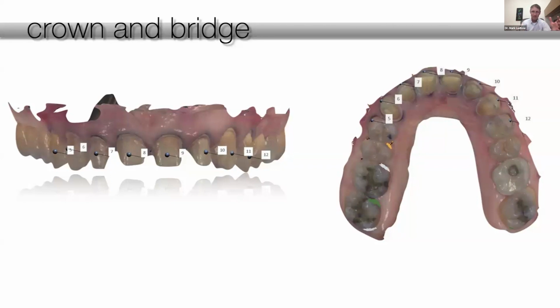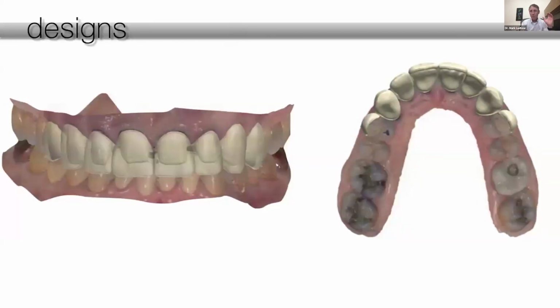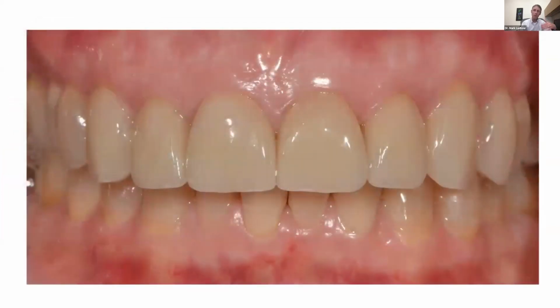So you have to make sure you've got good retraction, good heme control, all those different things from a crown and bridge perspective. Now, one of my favorite things is that the second we're done, we can hit the button and it immediately goes to the lab. Because I don't know about you guys, but with myself and my assistant, we are just abysmal about getting things off to the lab on time. That's why I love digital, because it's just hitting a button and boom, it's already there. So the lab can start fabricating things, we can get very nice results, and go from there.